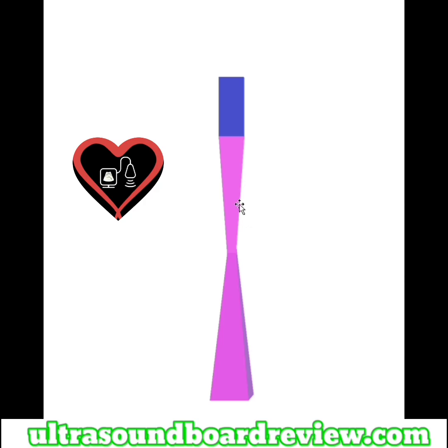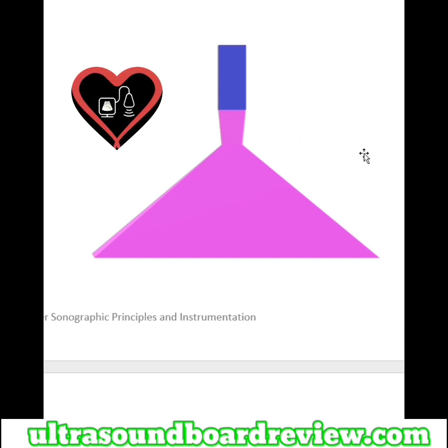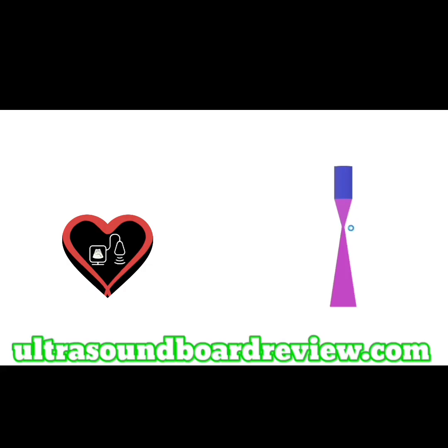The reason why your focal depth increases is because with higher operating frequencies, we're using a larger, thin crystal. When we use a smaller crystal, what's going to happen is our focal depth or focal length, our near field, and our Fresnel zone will all decrease. And what happens is, because it shortens the near field or the focal depth, your far field is going to extend out more extremely like this, and our penetration will decrease.